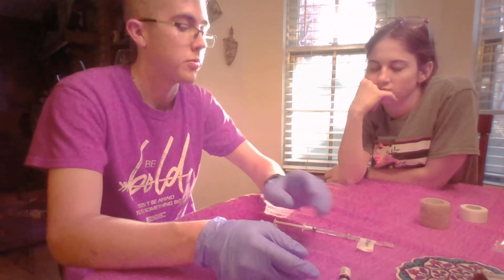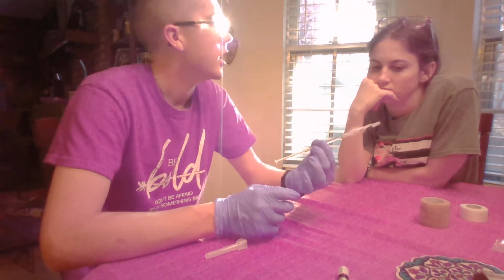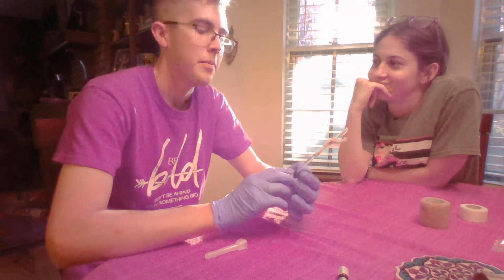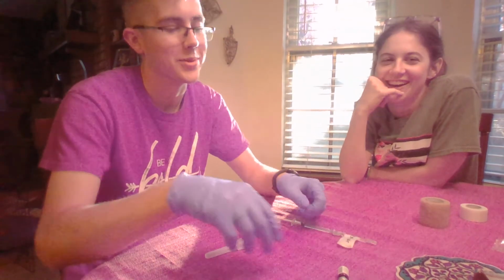I don't know if I did this before, but to explain the procedure that's going on, I'm going to be administering this pretty quickly into your nose. You may feel some discomfort, but it's intended to be inhaled. Okay? Well, go into your nose.